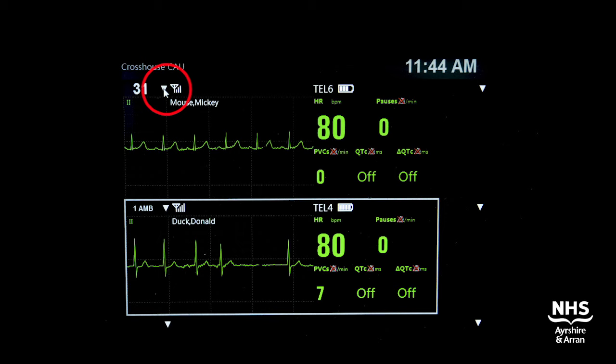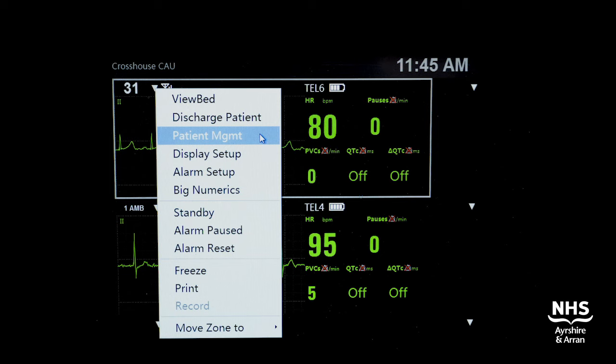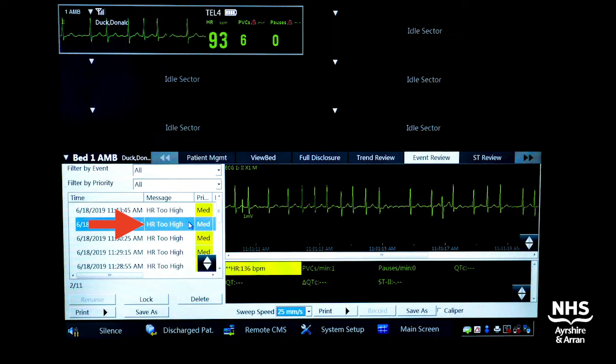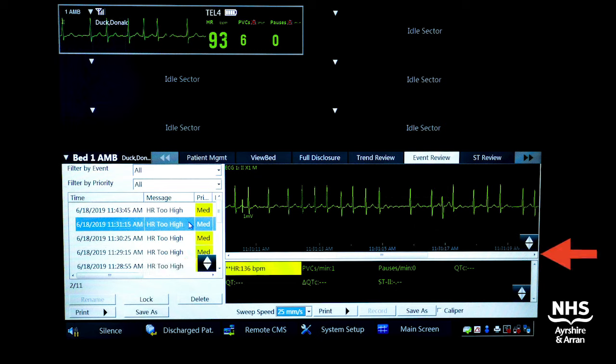Click on the top left triangle at the top of the screen. From the drop down menu, click patient management and then click on event review. Highlight the specific alarm in question. You can scroll through the alarms using the up and down arrows and scroll through the rhythm strip using the left and right arrows. To print a rhythm strip, simply click print once the rhythm strip in question is on the screen.